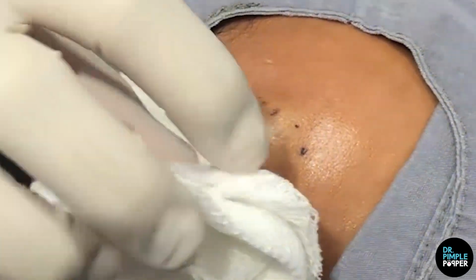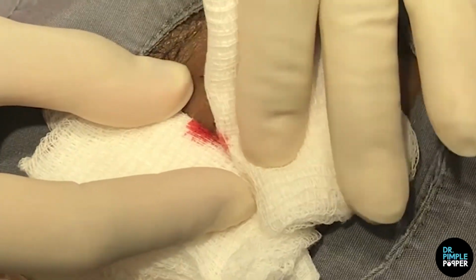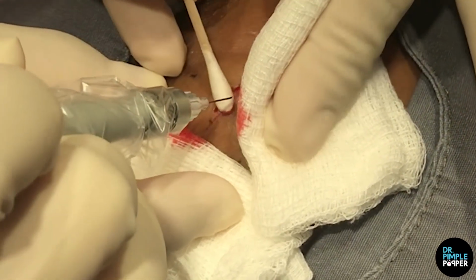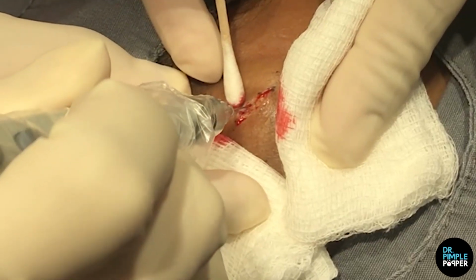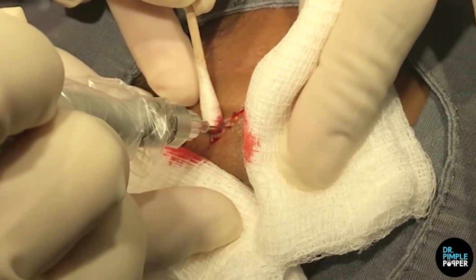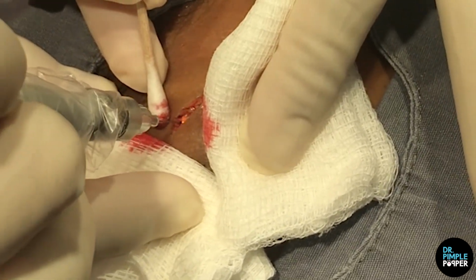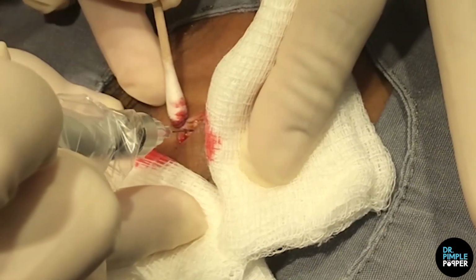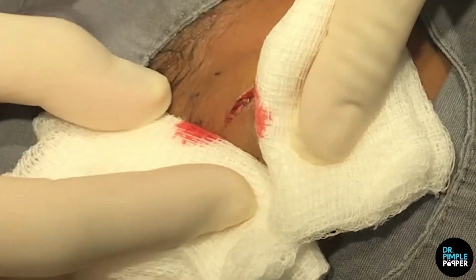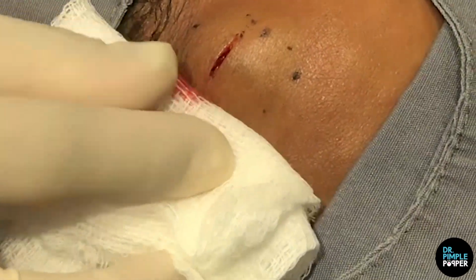So you're gonna hear a little buzzing noise. Okay. It's just a cautery that stops little baby blood vessels from oozing a little bit. Gonna buzz it here. Nothing hurts, right? Nope. Okay, good. Let me see if I can get to this now. I think I'm right over the top of it.